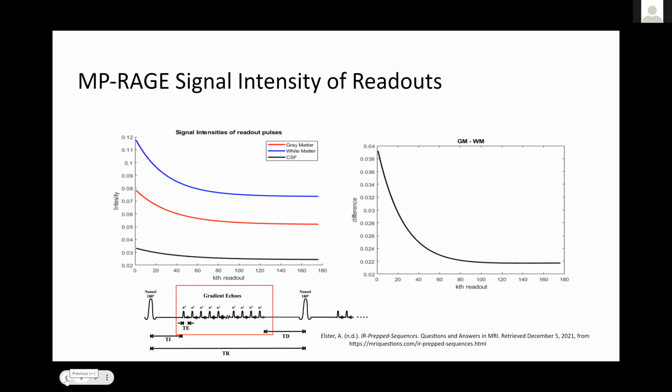I see. So you're acquiring an inversion time that's close to nulling out CSF. Yeah. Specifically, it was a TI effective, which would be the TI where you had a max value. Mm-hmm. So yeah. Great. And do you know on which of those excitations you're going through the center of K space? Are you doing centric encoding or linear encoding?